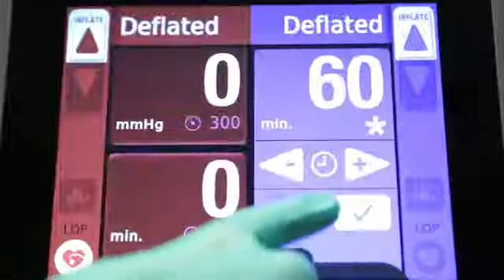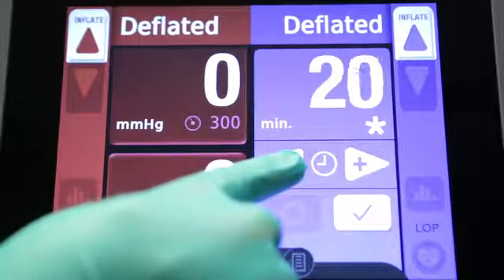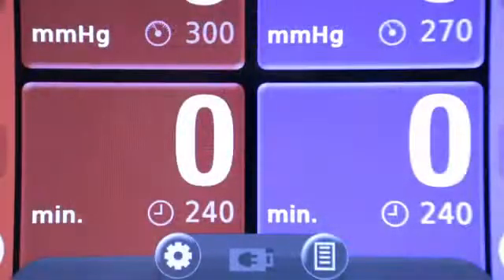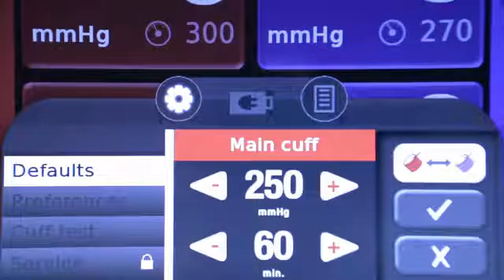The time tile functions in the same way. Tapping the tile shows the current time setting, and the arrows can be used to adjust the time from 1 to 240 minutes. To change the default pressure or time setting, tap the settings icon on the bottom of the screen, then tap the default menu button. The factory default pressure setting is 250 mmHg and the default time is 60 minutes.